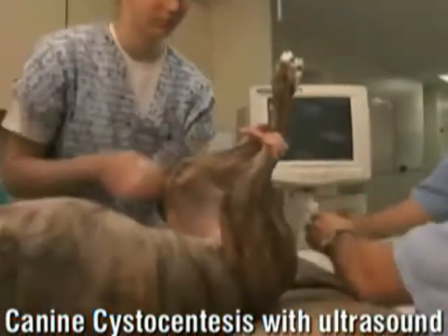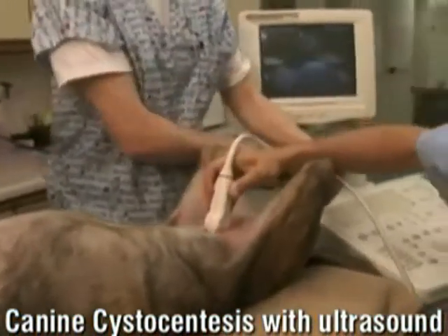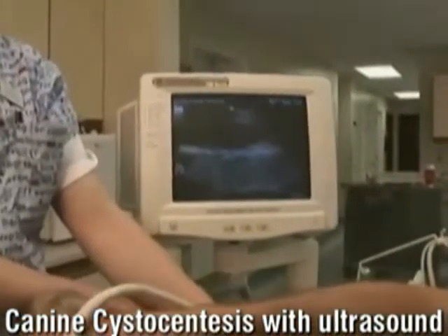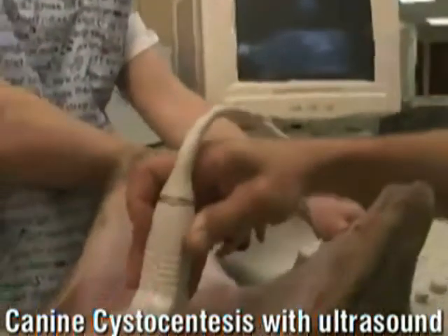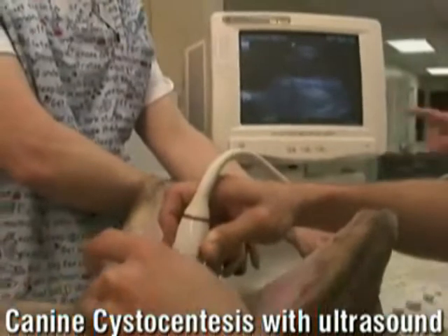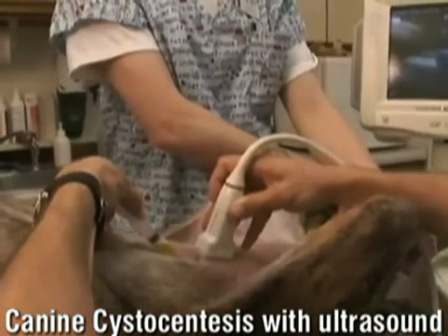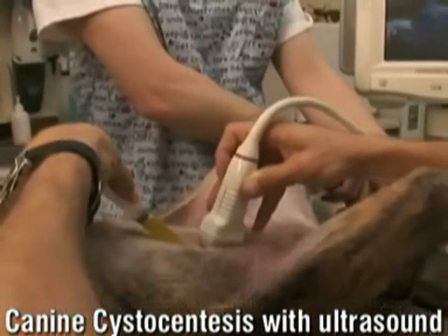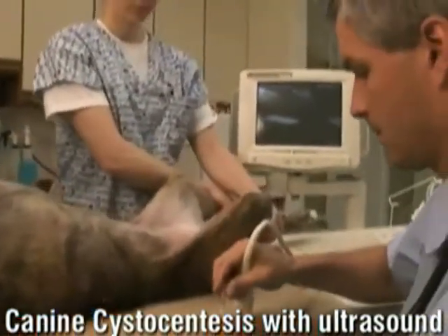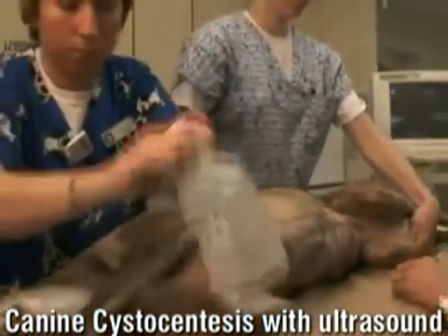So now we're going to demonstrate urine collection using ultrasound. Dr. Rider is going to ultrasound the bladder of our greyhound here. The nice advantage is that if we have a bladder that's small, we can see it on ultrasound and it's usually pretty easy to get urine. The other thing is we can look for stones and tumors — a huge advantage with ultrasound, just to make sure there's not some underlying disease. Usually we put them in dorsal recumbency like this, though sometimes laterally depending on the dog. Put a little alcohol on there, which just helps the ultrasound probe with the sound waves. Here you can see the bladder — that dark area — because urine and fluid shows up black, or hypoechoic, on the ultrasound. Now Bob's going to go ahead and introduce that needle to get a urine sample. Right here you can see the needle — which is kind of neat.